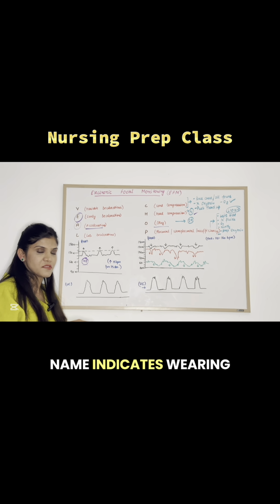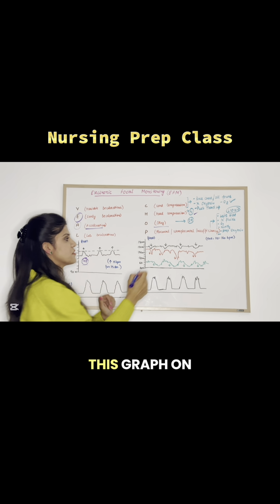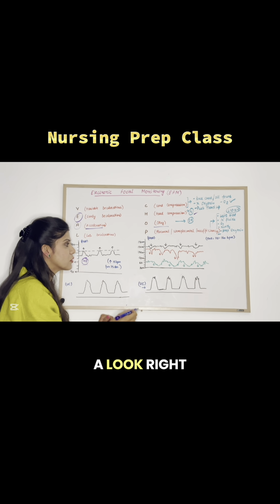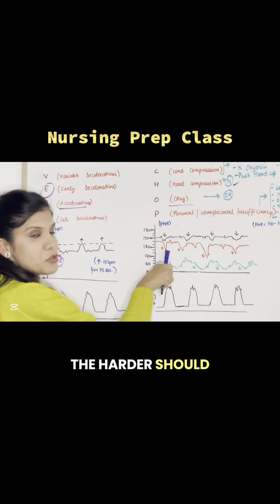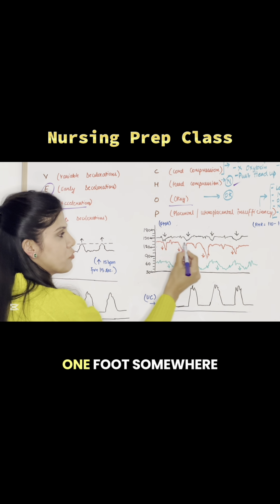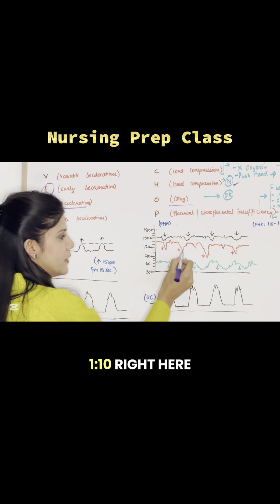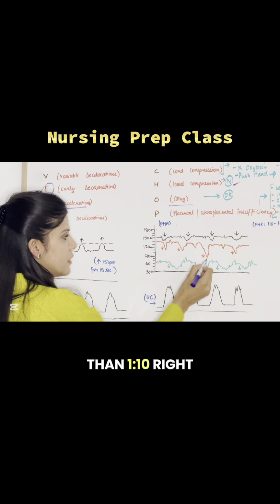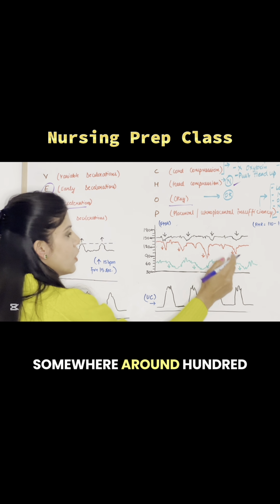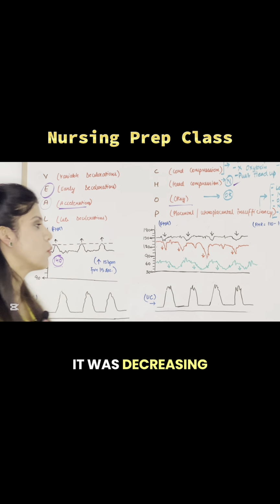No interventions are needed. Now let us take a look at variable decelerations. Variable, as the name indicates, varying, it varies. Now how do we know that it varies? So take a look at this graph on the red graphical data right here. So in front of the uterine contractions, the heart rate should be low, and it did get low, but look at this, the baseline here was somewhere around 140, but it dipped to somewhere like 110, and then 110 right here, but way below 110 right here, somewhere touching the 90s, and then again somewhere around 100 right here. So the heart rate was decreasing very low. It was decreasing way too much.